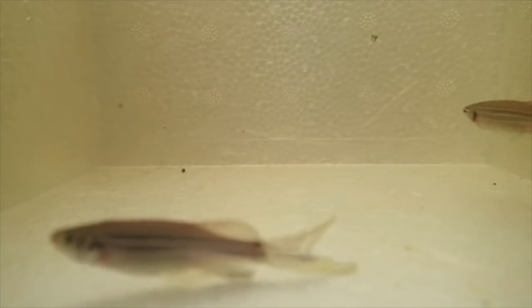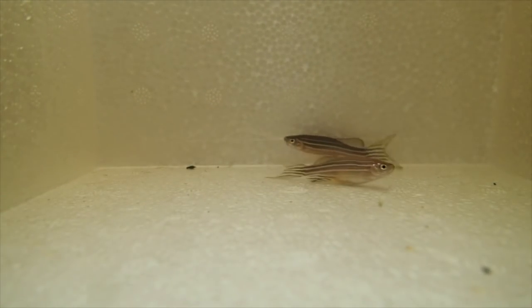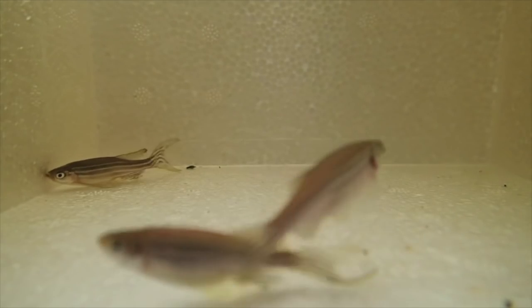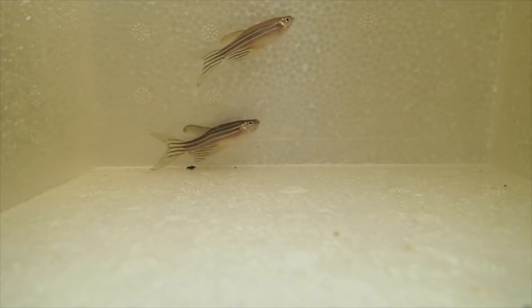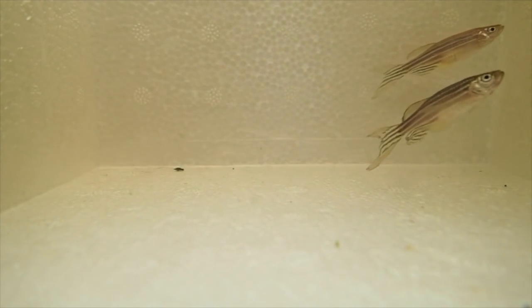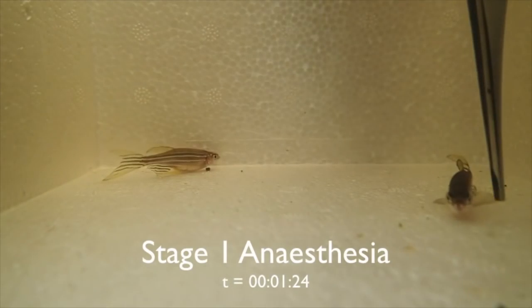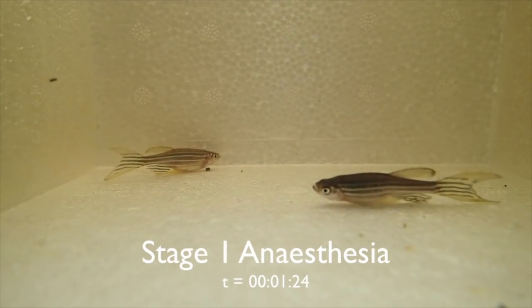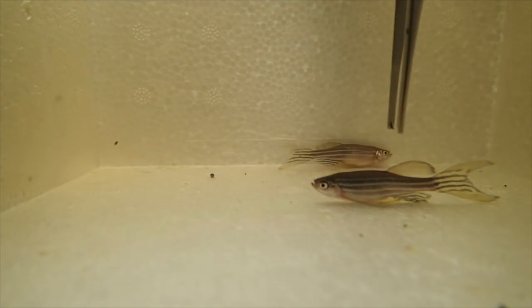The fish is swimming aimlessly and crashing into the sides of the tank. You'll also notice that as fish become anesthetized they lose the ability to maintain their level in the water column and they'll sink to the floor. Here we've entered stage 1 of anesthesia, and within 10 seconds we've jumped into stage 2.